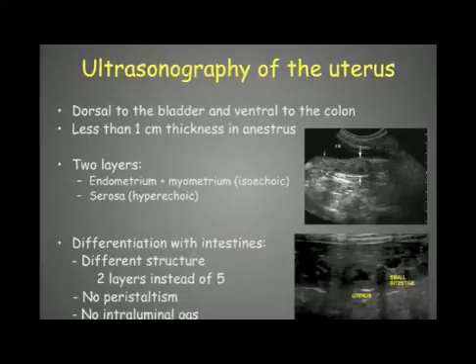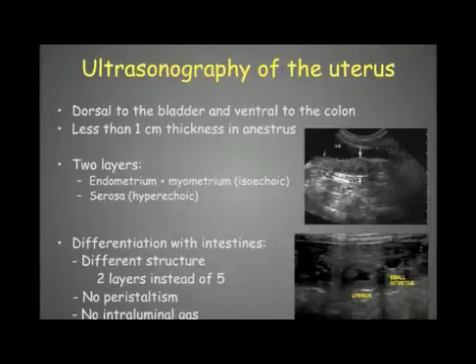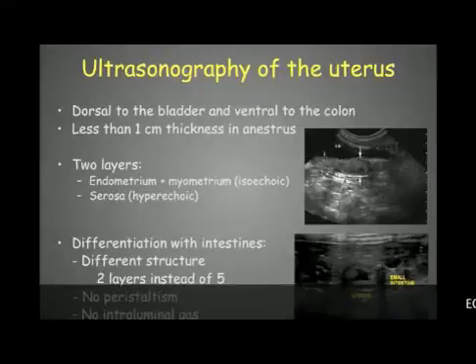The uterus is located dorsal to the bladder and ventral to the colon. As we can see in this image, here we have the urinary bladder, the uterus, and the colon, which is easily recognized by the gas located in its lumen.